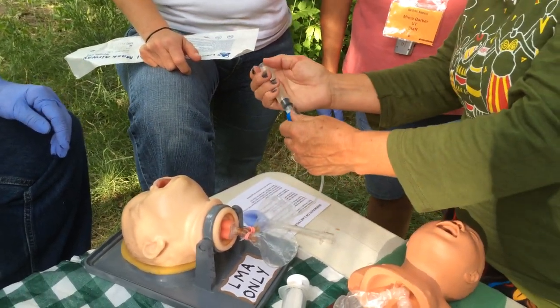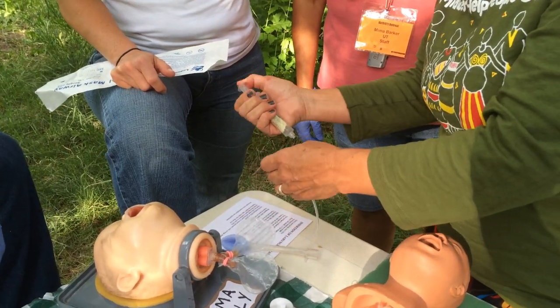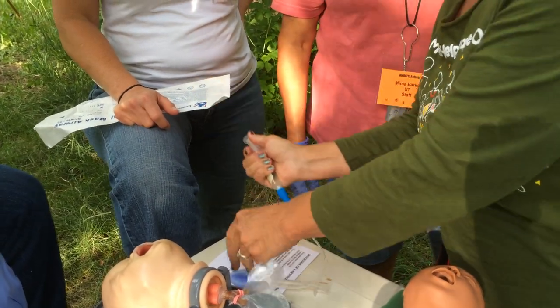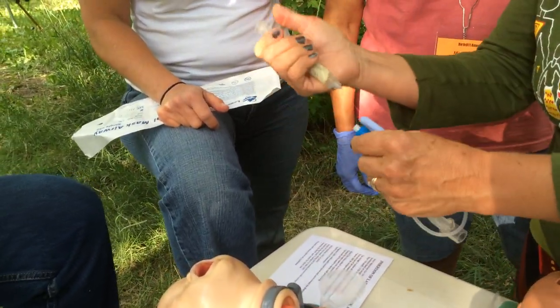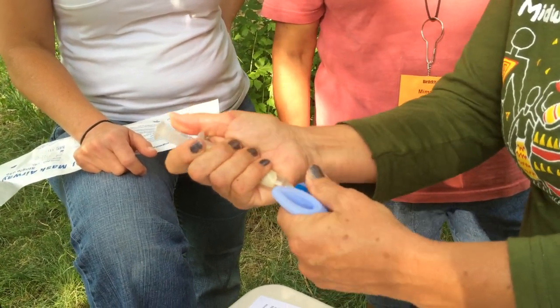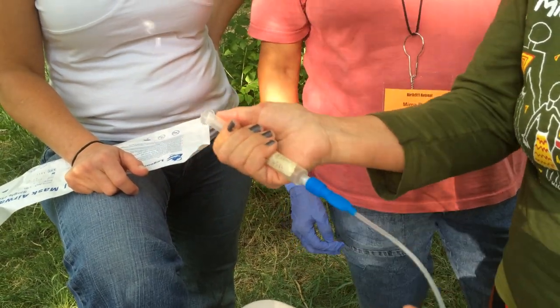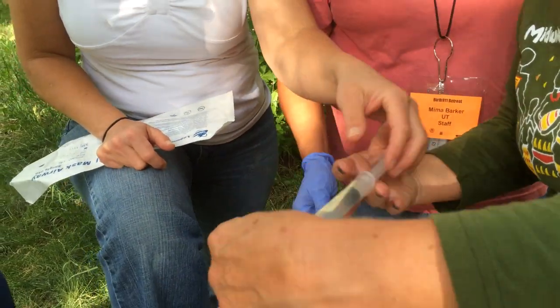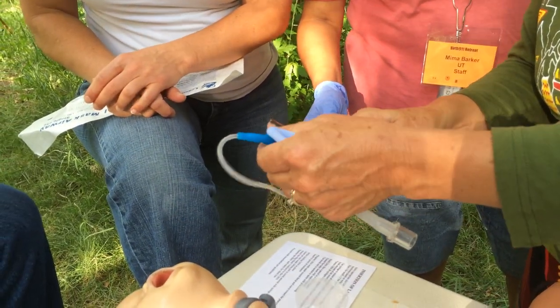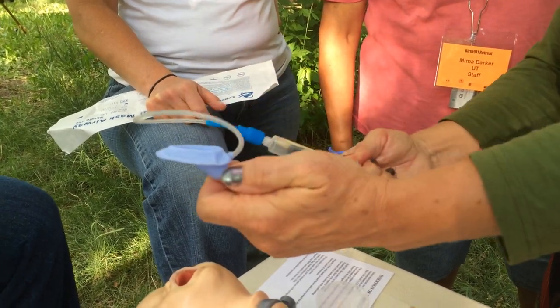Can we do it the other way now? Because it's flat. You just wanted to get the different consistencies. Must have used it too many times. Sometimes the gauge will break. It's supposed to hold 1.5 for a larger baby. See, it's not flattening no matter how much air I take out of it, so it's got to have a hole. Oh, no. So it's not working. I just have to get another one. There we go. It worked.